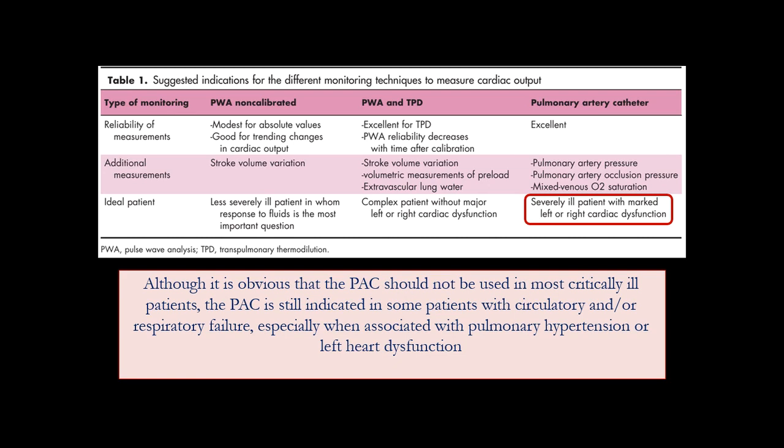Although it is obvious that the pulmonary artery catheter should not be used in most critically ill patients, PAC is still indicated in some patients with circulatory and respiratory failure, especially when associated with pulmonary hypertension or left heart dysfunction.